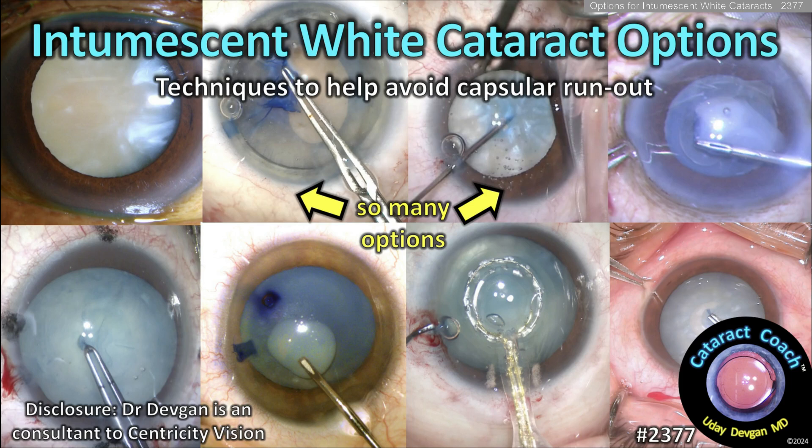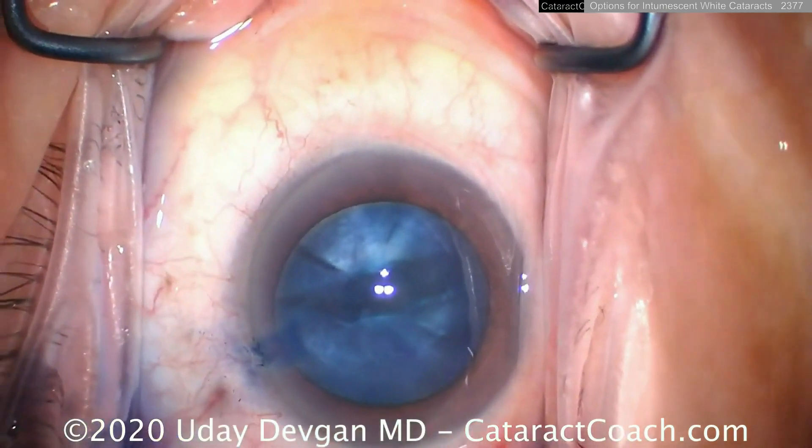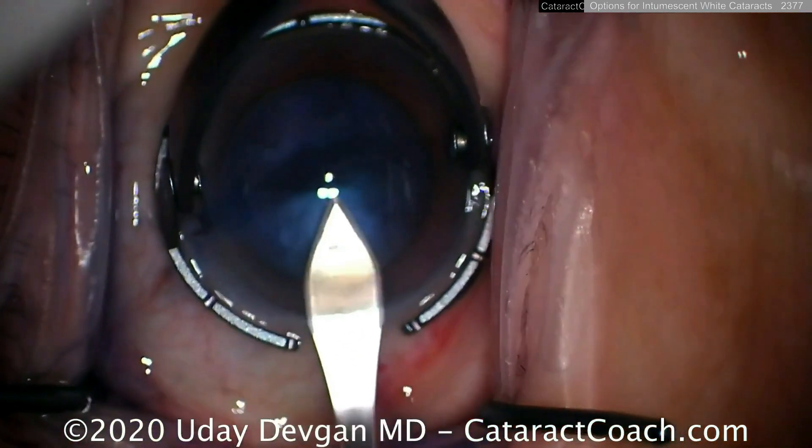cataractcoach.com — intumescent white cataract options: techniques to help avoid the dreaded capsule runout. We've shown this video before of a highly pressurized intumescent white cataract, and we can make our main incision here.